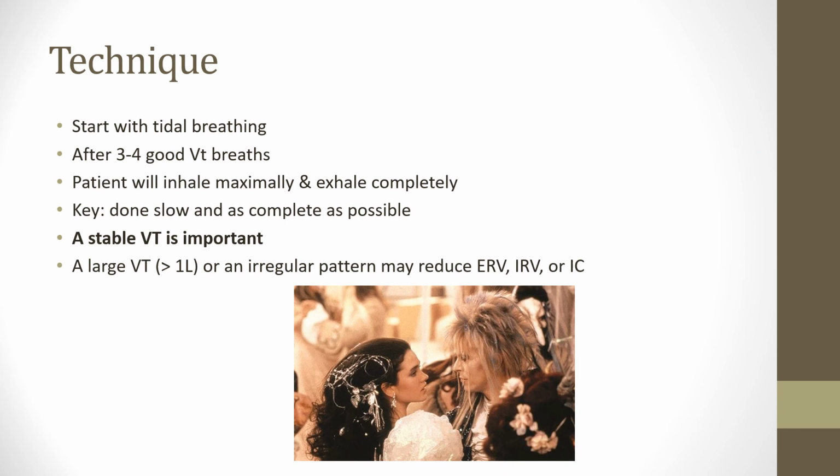All right, so the technique here for a slow vital capacity, so this is you coaching this. You're going to start with that normal tidal volume breathing.